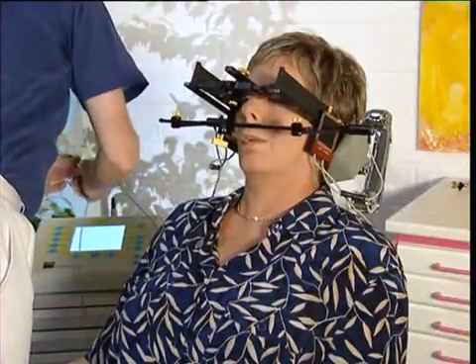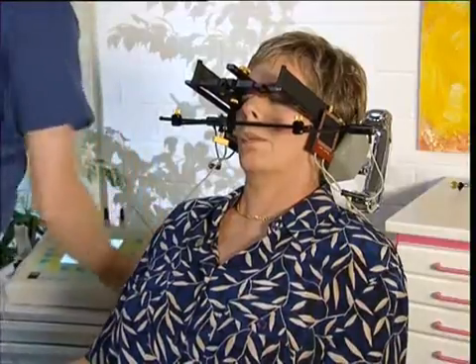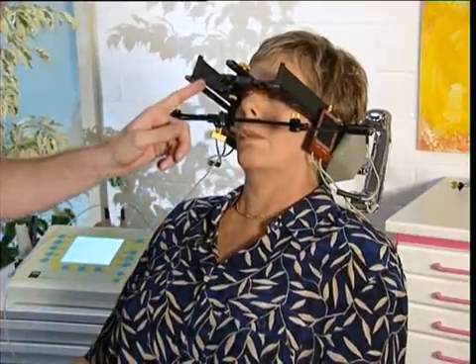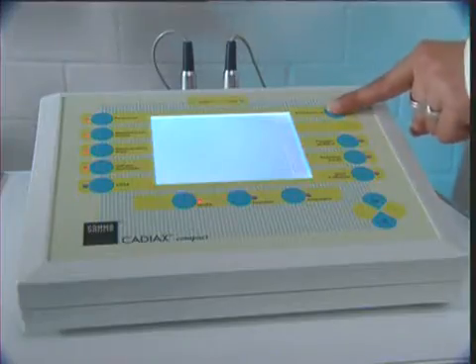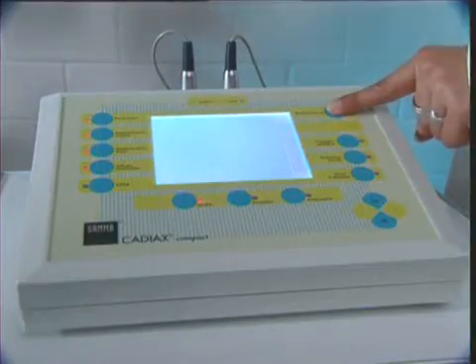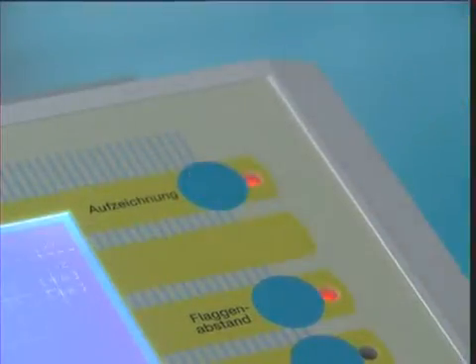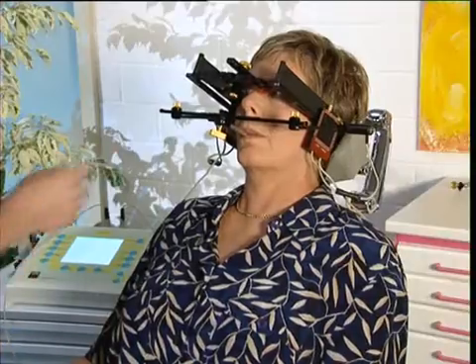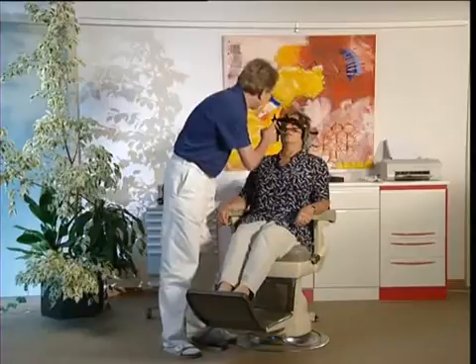The box is activated with the flip switch on its back. The last registration will be displayed on the screen. It is deleted by pressing the trace key for approximately 3 seconds. 3 short and 1 long beep confirm that it has been deleted. The key is then pressed again briefly to commence the new registration.